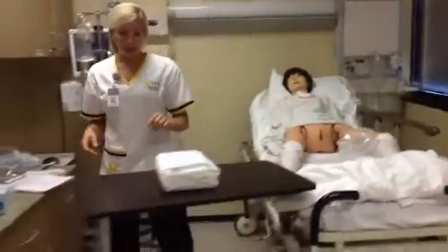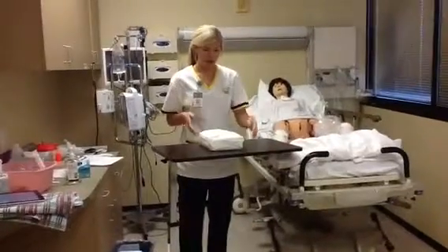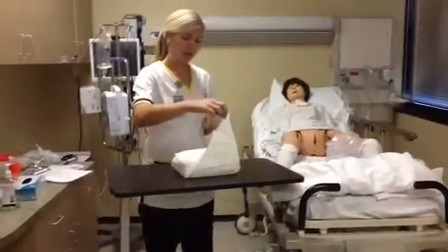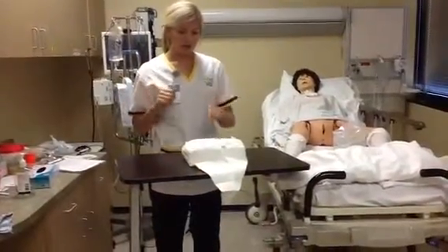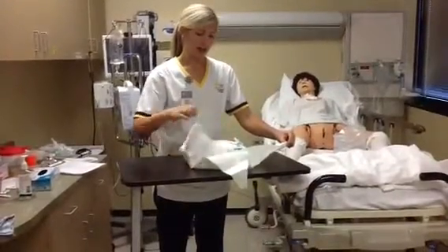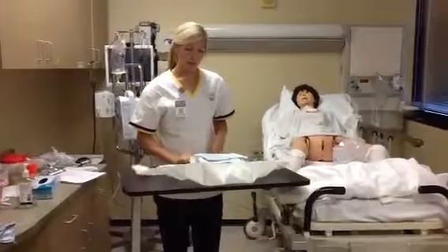And I'm going to perform hand hygiene as I begin to open this up. I'm going to position this so that it's a little bit easier. And to open it to begin, I'm going to open the first flap away from me. And as I do this, I want to make sure that I'm not reaching over my field ever and that my flaps do not open back over. So then I'm going to do the left field. And again, I'm only touching the 1-inch margin to make sure that it stays sterile. After I do left, I'll do the right one. And then I'm going to grab this last one and open it back.